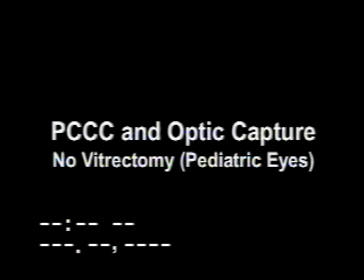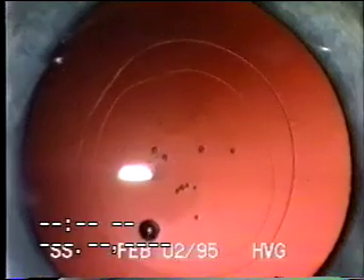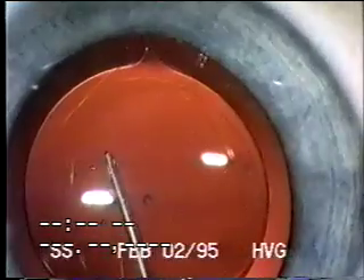Here's a surgical example of PCCC and optic capture in a pediatric cataract surgery done in 1995. You can see the posterior capsulorexis being completed — this needs to be a little smaller than the optic for good optic capture. The intraocular lens is then placed in the capsular bag; in this case we were using one-piece PMMA lenses. Then the optic is pushed through the PCCC for capture — no vitrectomy was performed. A little rotation was done for better centration, and you can see the posterior capsule leaflets over the optic, so both anterior and posterior CCC are over the optic.